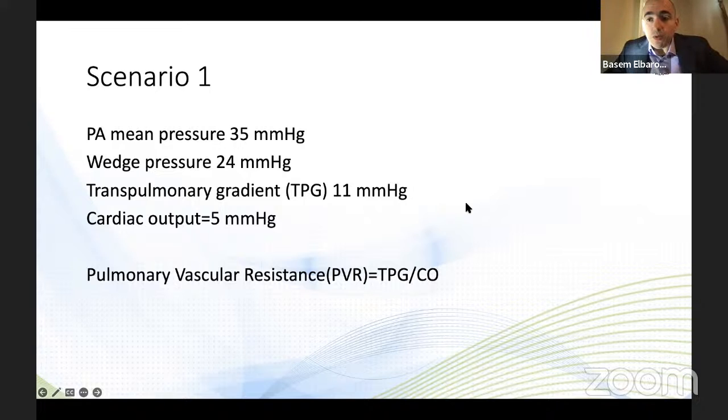So the procedure is done somewhat similar to right heart cath, but it also involves going in with a special device, a bioptome, to take a few samples. Usually what I do is a right heart cath at the same setting, take the full samples, the pressures, and then I do the biopsy part. It's more for the biopsy part, not just the right heart cath.